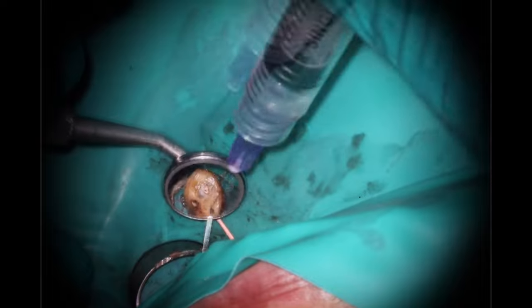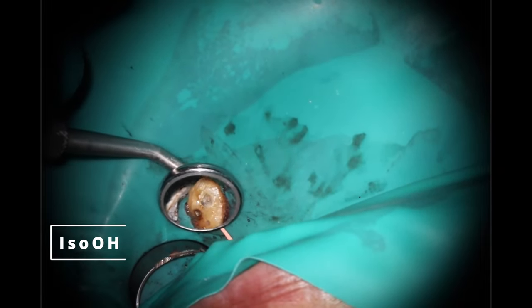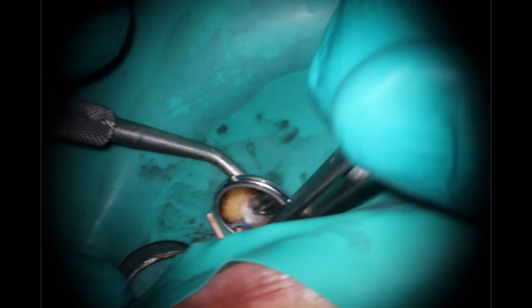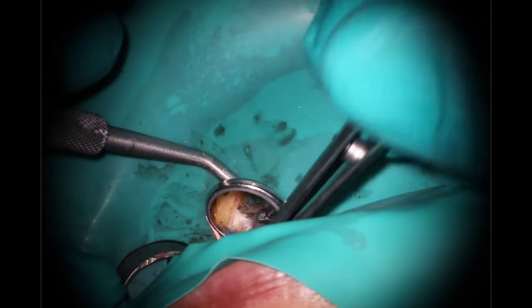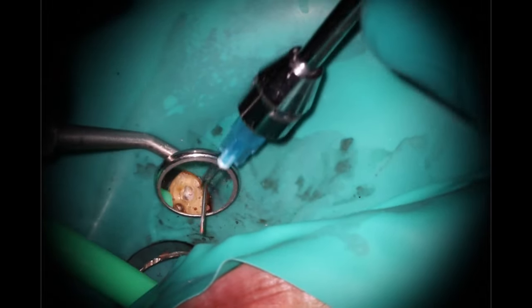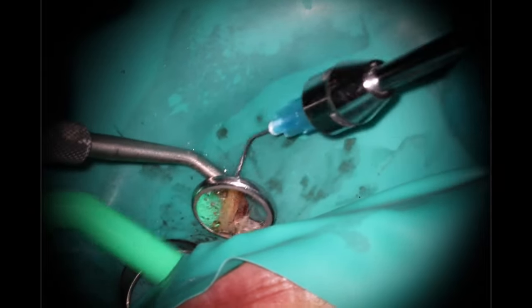I'm going to rinse this all out and make sure it looks good. This is more time than I would normally have to spend on this case, but because of the angulation and just what we had to deal with, definitely a challenging one. I could have made it easier by making the hole a lot bigger, but I didn't want to cause damage to the tooth. So going in with the isopropyl alcohol just to remove any remnants of sealer so they won't have issues with bonding.